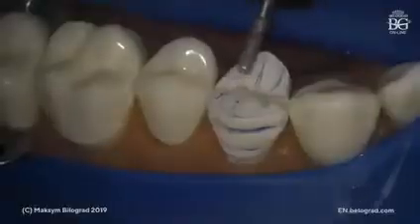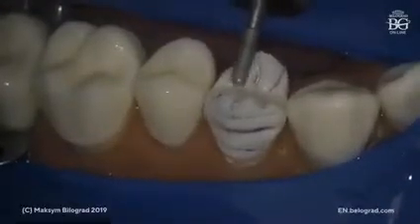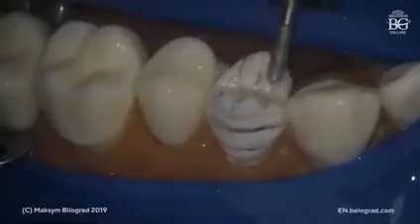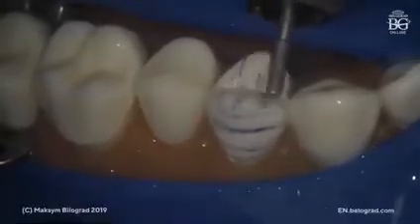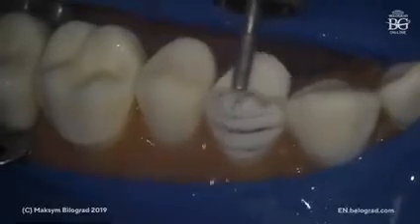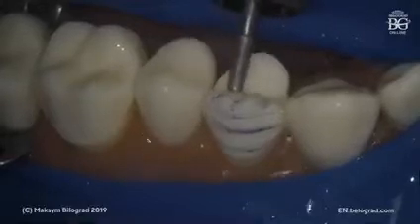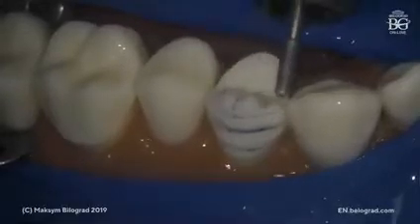I will now take this burr and start preparing the occlusal surface, palatal, all the way until you lose the grooves.